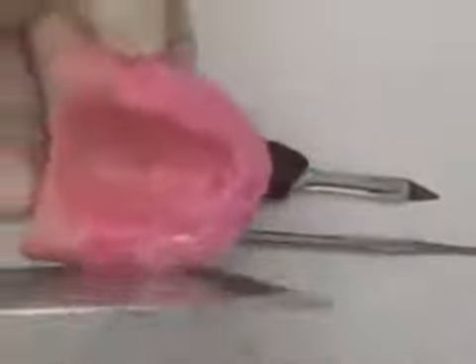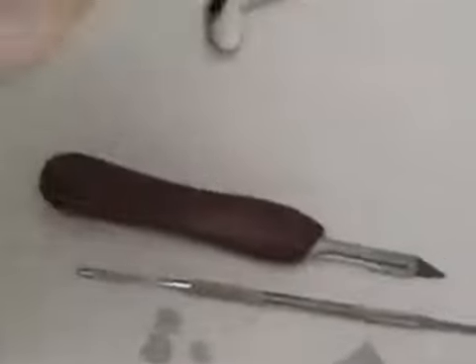Don't try and use your Hanau alcohol torch, it's not hot enough. Then use the side of the wax former to get a nice flat surface to both the buccal surface of the rim and also to flatten the occlusal surface so that when you're making your occlusal records, you have a nice flat surface both on the maxillary and the mandibular rim.